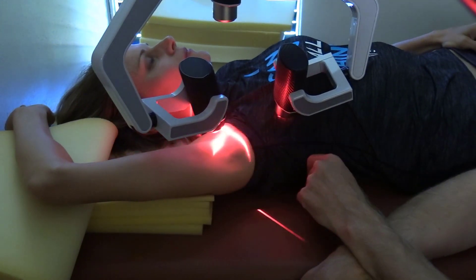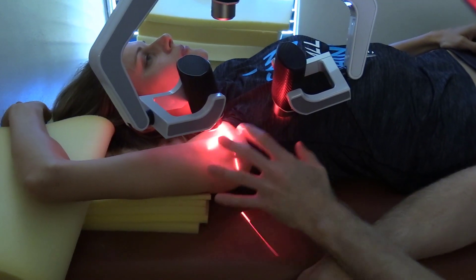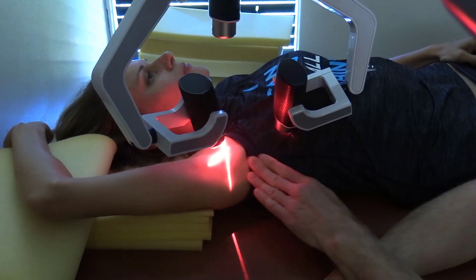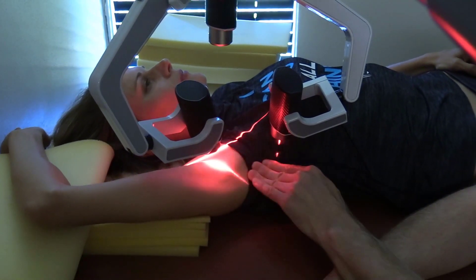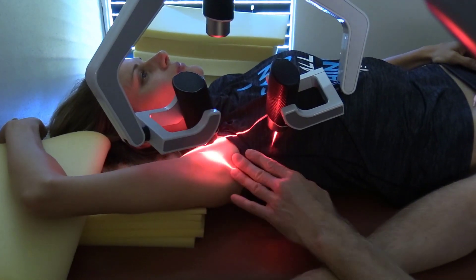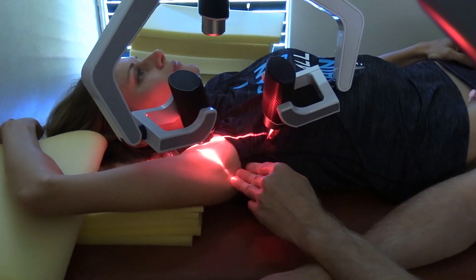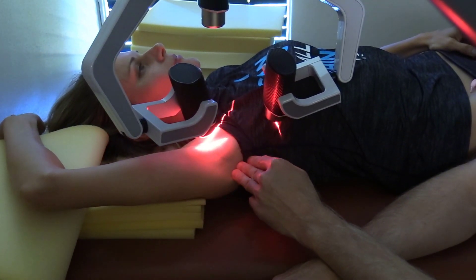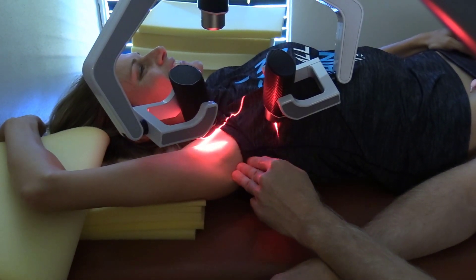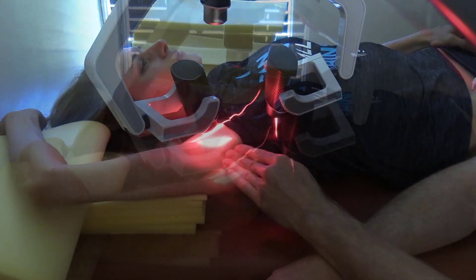The scalenes are done a slightly different way — the person's still on their back and you just have the laser set up a little differently. There's a lot to do in the axilla, but you just have to start getting used to feeling down here what's normal. For people learning the lasers who don't really know the muscle anatomy very well — if ever you question something, whether it's hard or not, or whether it's bone or not, just laser it. If it's bone, it'll stay hard. If it's muscle, it'll soften up and you've learned something. That's just how you go about learning this stuff.